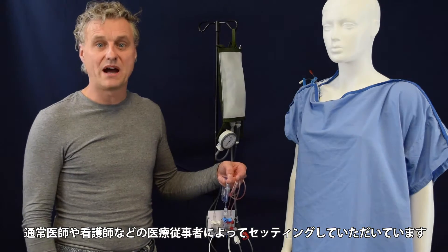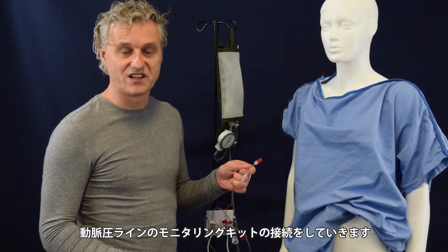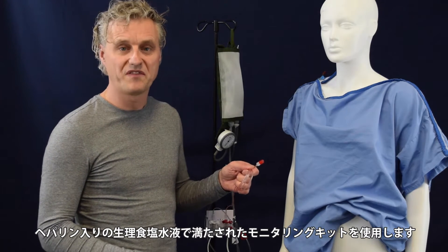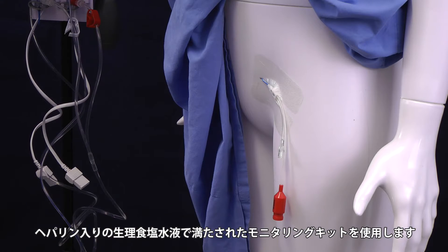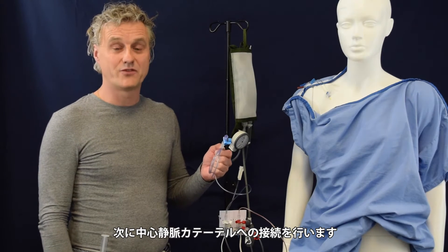This will normally be done by a doctor or by a nurse. Let's start with the arterial pressure transducer. When the pressure transducer is properly flushed by a doctor or by a nurse, we can connect it to the Pico catheter. The next step will be the central venous pressure.